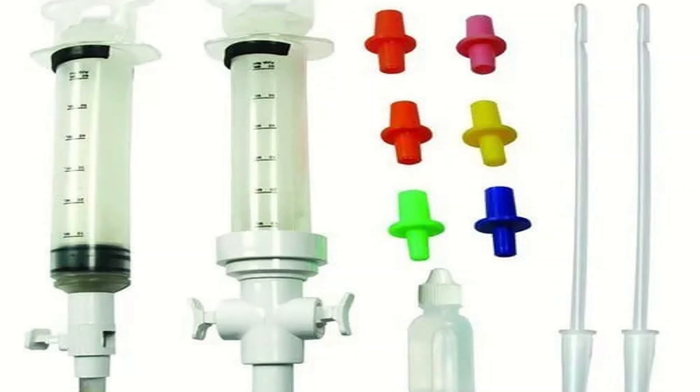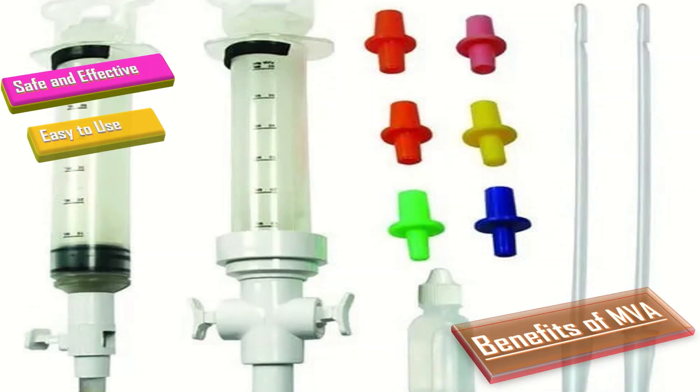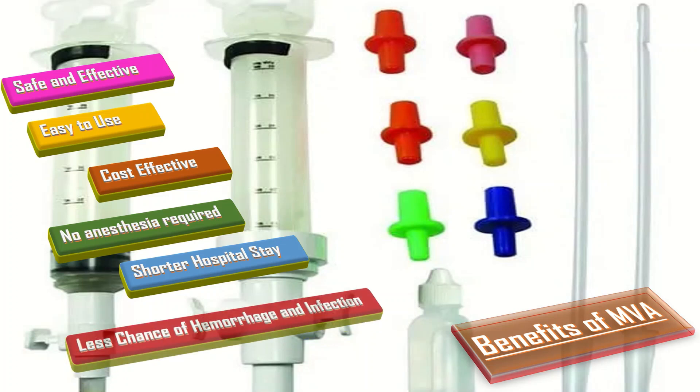What are the benefits of MVA? It is a safe and effective method, easy to use, and cost-effective. No anesthesia is required. There is a short hospital stay required, and there are fewer chances of hemorrhage and infection with this type of procedure.